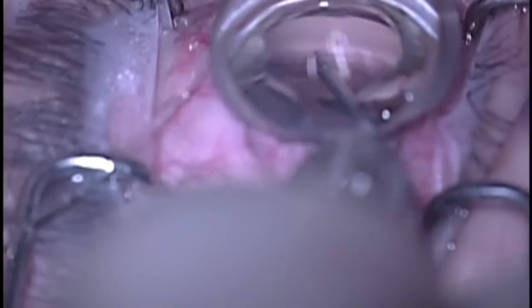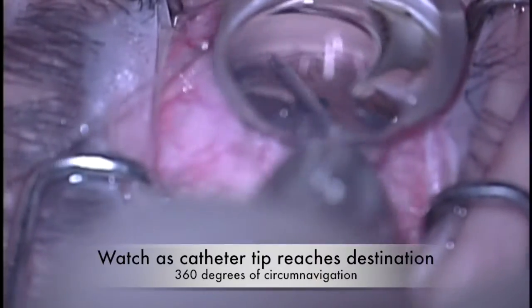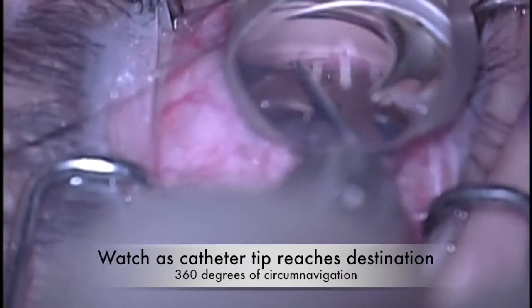When using the gonio lens, you can see the fiber optic probe reach its final destination, which is complete circumnavigation of the canal.